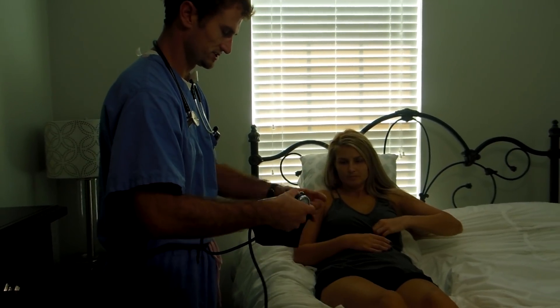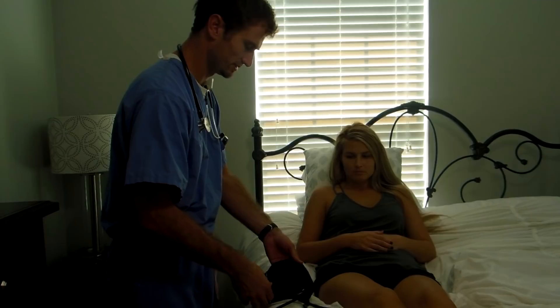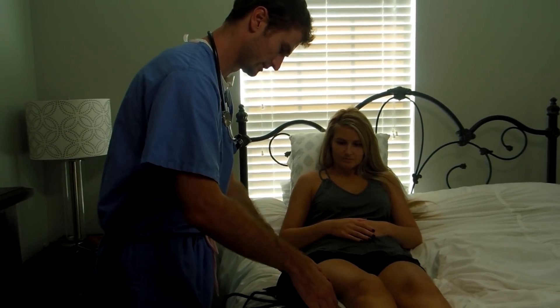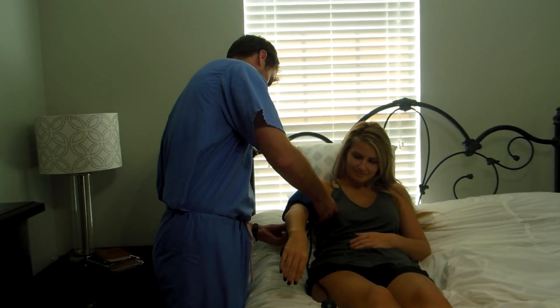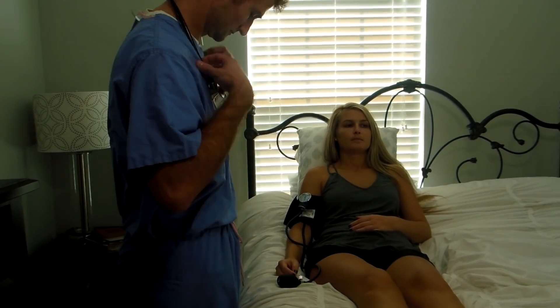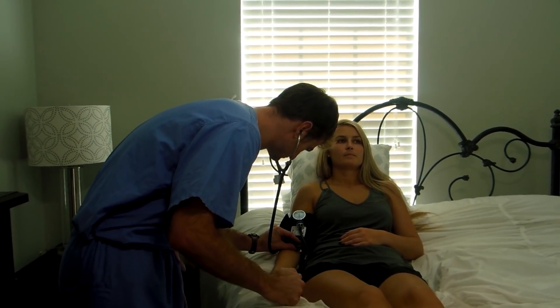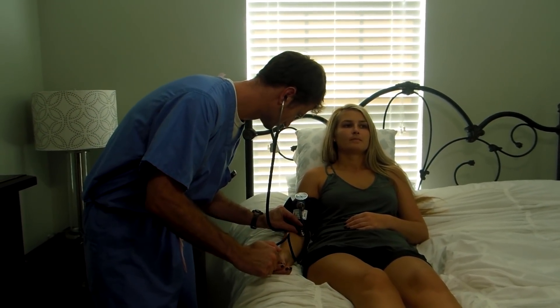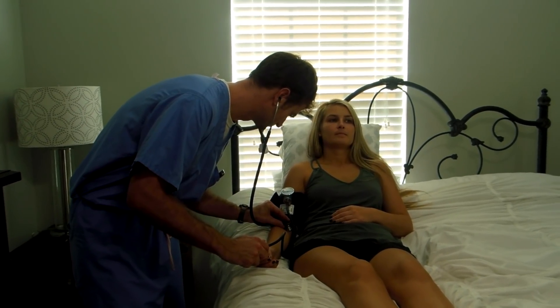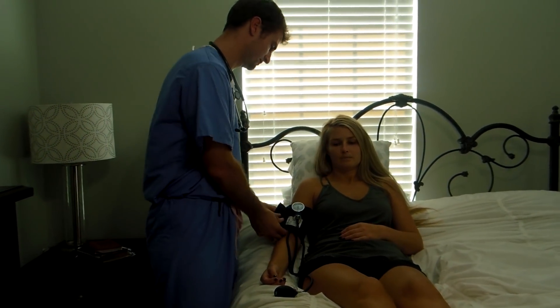Before I get too far, I'm going to check your blood pressure. Do you have any concerns about the exam or anything I need to be aware of? Any pains anywhere? No. Let's slide this on your arm. I'm going to have to blow this up, so it's going to get a little bit tight. Relax for me. So your blood pressure is 115 over 72. That's normal.